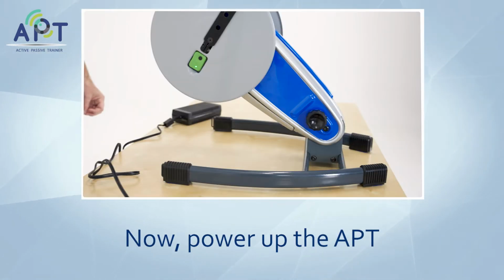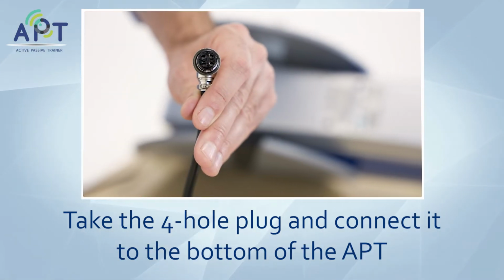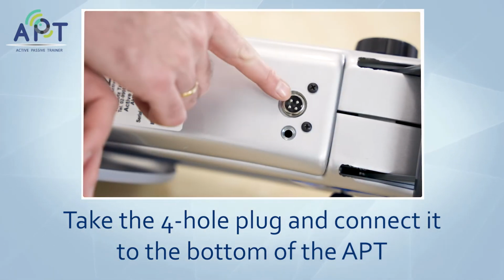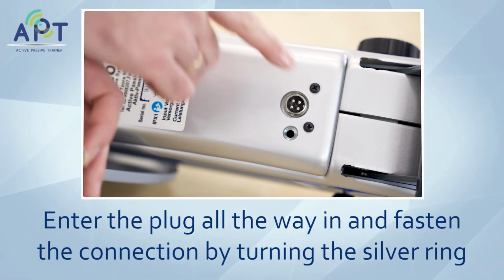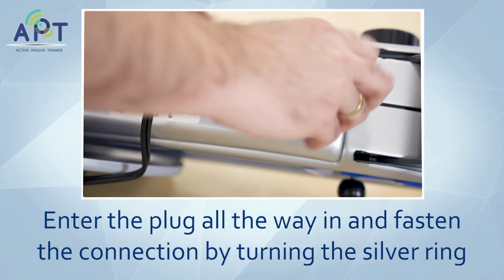Now, power up the A.P.T. Take the power supply and place it near a power source. Take the 4-hole plug and connect it to the bottom of the A.P.T. Enter the plug all the way in and fasten the connection by turning the silver ring.